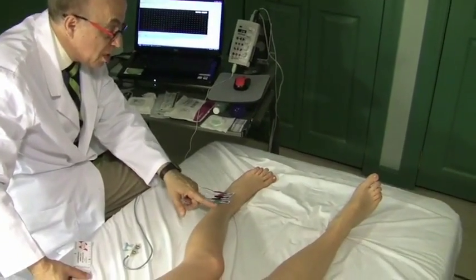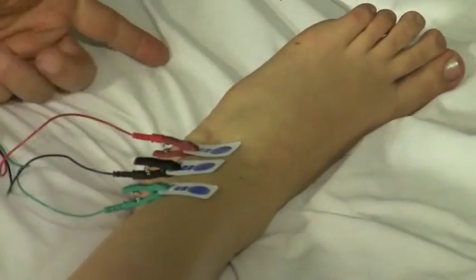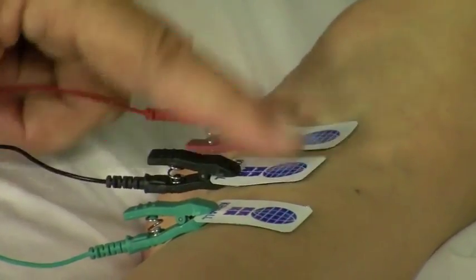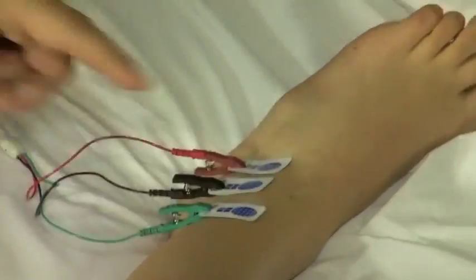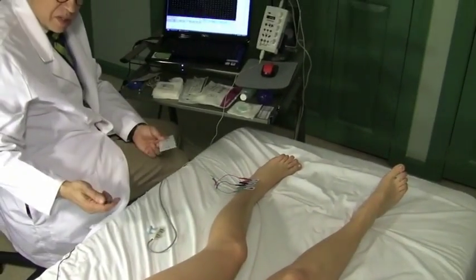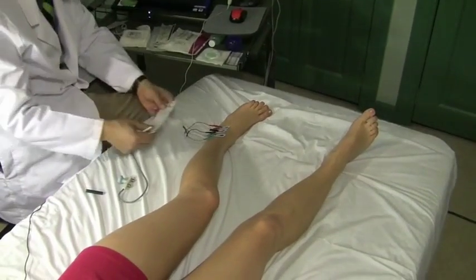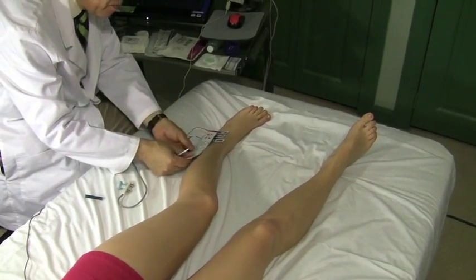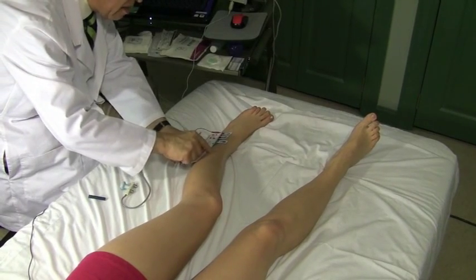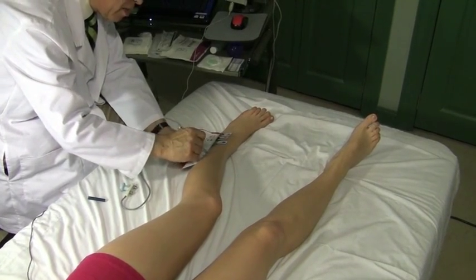For that, we're going to put the electrodes exactly the opposite from the sural. For the sural, we put it behind the malleolus. Here we put it in front of the malleolus and the ground in between. And now we're going to measure 12 centimeters. That's the distance that I use because I calculated normal values based on that. From the black to right here, the middle of the leg, right in front of the calf. Okay, and that's the 12 centimeter point.